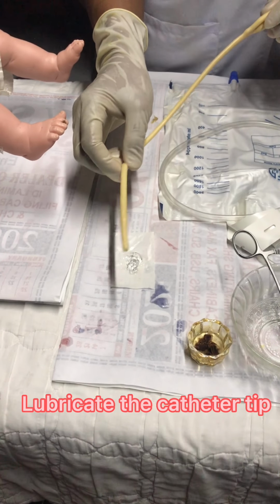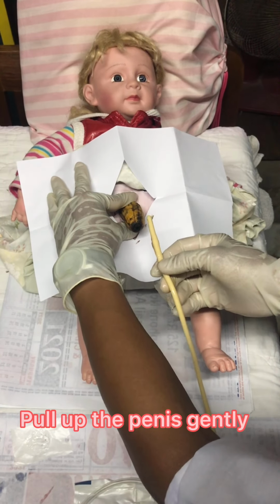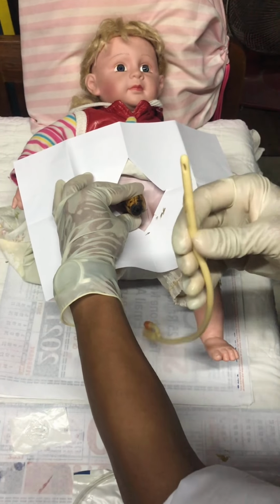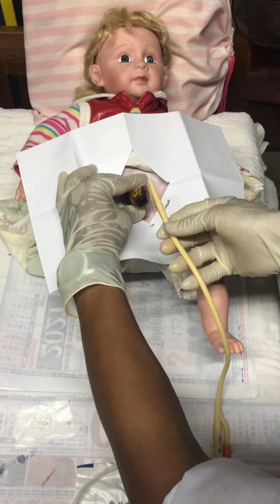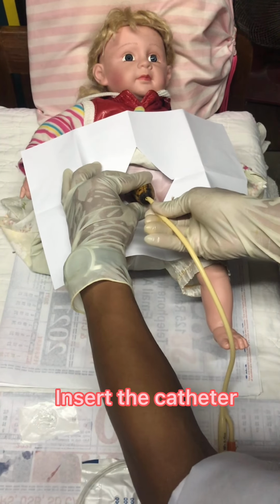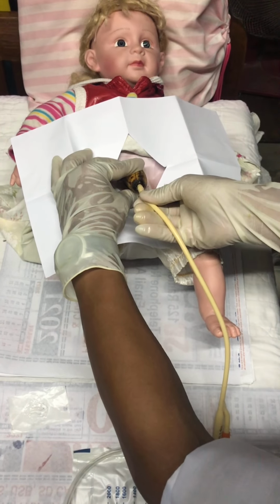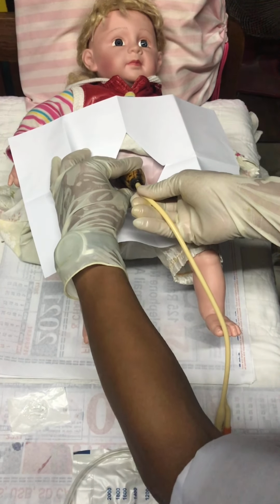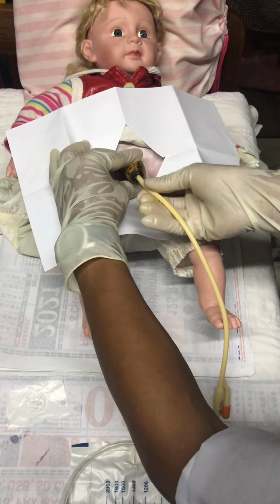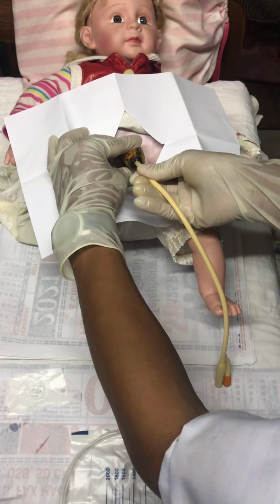Lubricate 6 to 8 inches of the catheter tip. Hold the penis perpendicular to the body and pull up gently. Hold the catheter in the dominant hand steadily and insert the catheter about 8 inches. Do not force the catheter through the urethra. Then ask the client to breathe deeply and rotate the catheter gently if slightly resistant. Ma'am, breathe deeply.